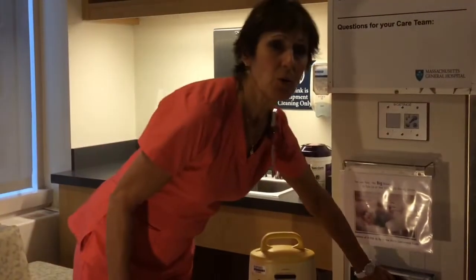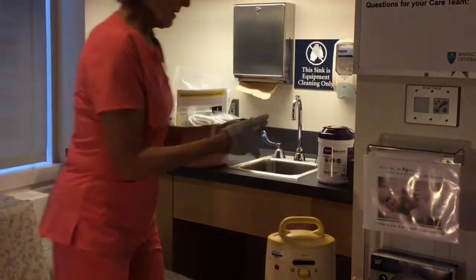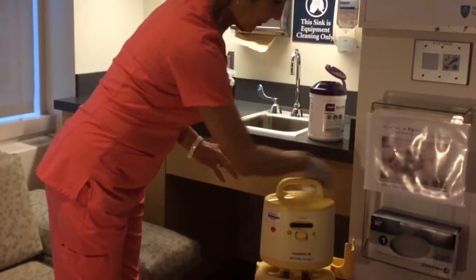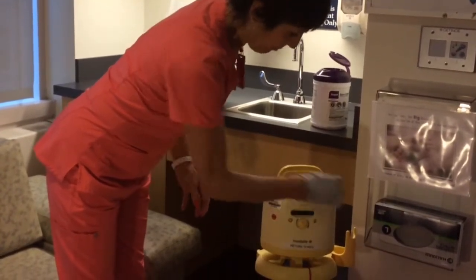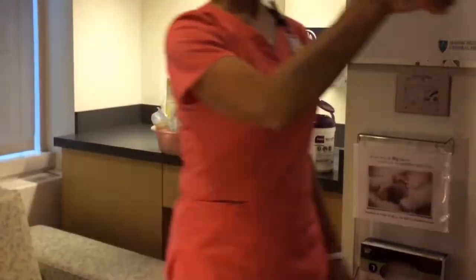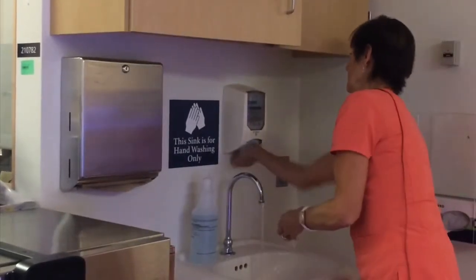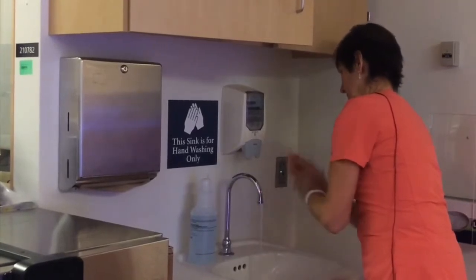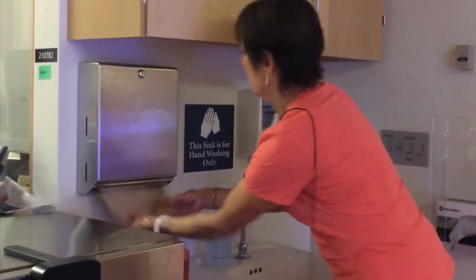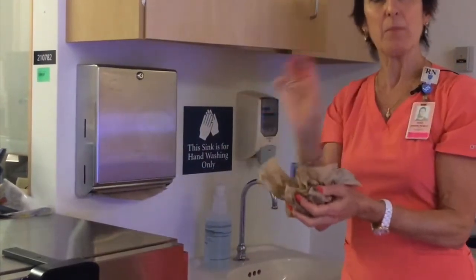The first thing that you or a mother should do before they pump is put on a glove, take a disinfectant wipe and wipe the outside of the pump where their hands are going to touch the pump. Throw that away and then wash your hands in the sink by the door. Then the hands will be clean and the pump will be clean.